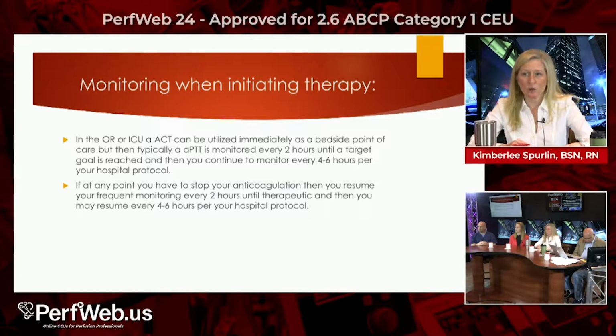Monitor every 2 hours until a target goal is reached, and then you can continue to monitor every 4 to 6 hours depending on your hospital protocol. So I say 2 hours, but you have that patient that's super oozy. It's easy to do every hour, every 30 minutes. We gave some product, let's see where we're at now. I completely agree with that. The sooner, the better. And the 2 hours, that's a good number.